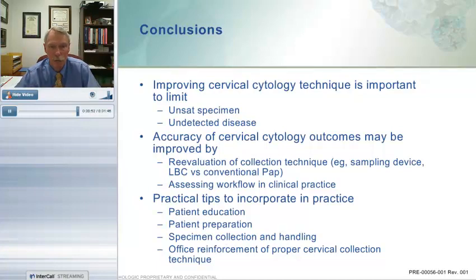And I don't see any further questions. Again, I want to thank you sincerely for your participation in the webinar. I think that we have reviewed the collection technique, and I think that the two things to remember are, if you can't see the cervix, you can't get a Pap smear, and if you can see the cervix, careful attention to detail will afford you the minimum number of unsatisfactory reports and the maximum number of non-failure to detect disease.